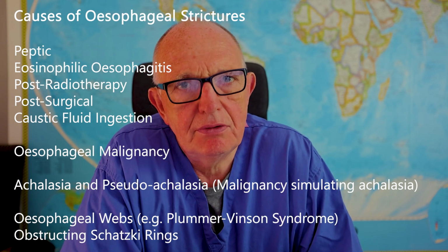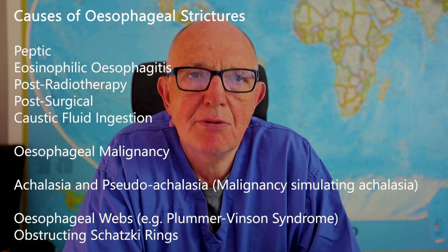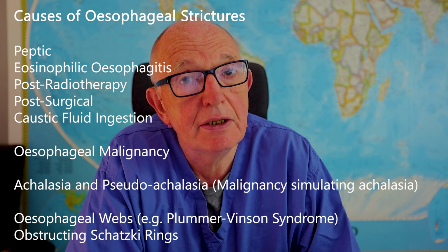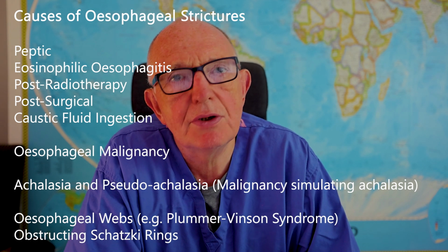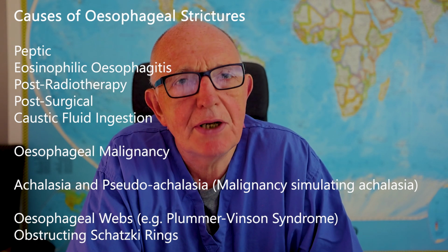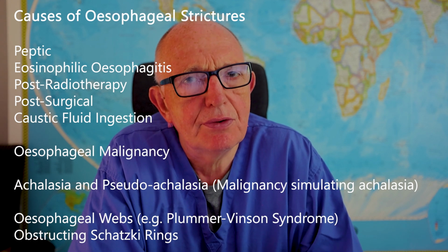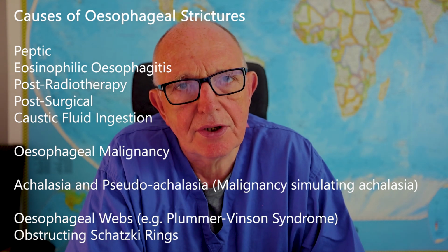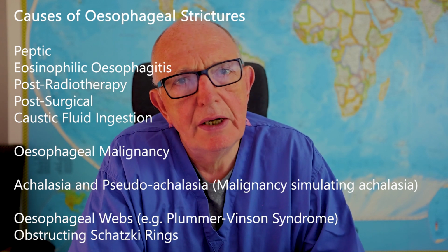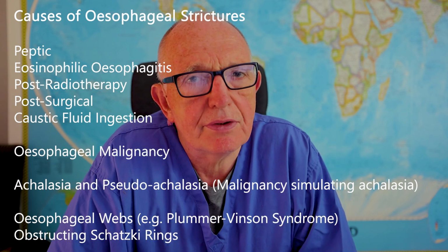We tend not to dilate malignant strictures, although sometimes in a palliative setting that is appropriate, so it's a relative rather than an absolute contraindication, but we really try not to, particularly in the primary setting. We don't want to perforate a cancer and go from a potentially curable to a potentially disseminated situation. So part of the assessment is to make sure that we're not dealing with a stricture that is malignant or an achalasia that is actually a pseudoachalasia, where you tend to have a shorter history in an older patient than what we normally see with achalasia.